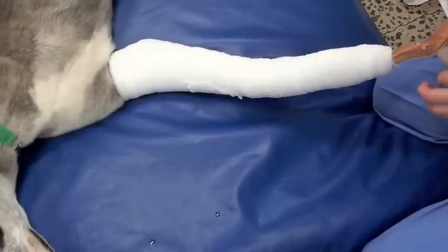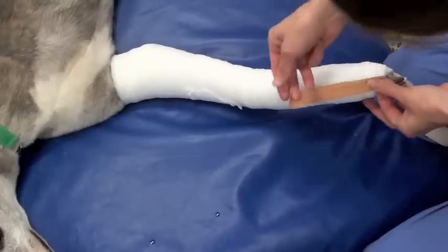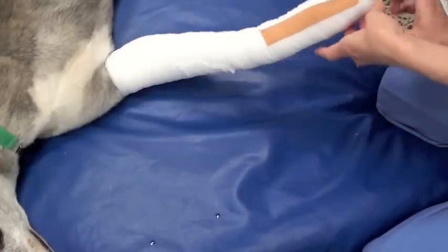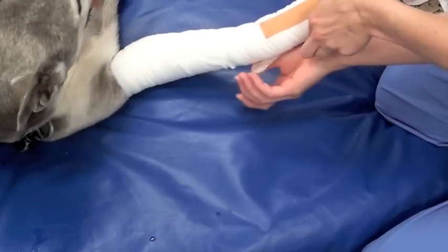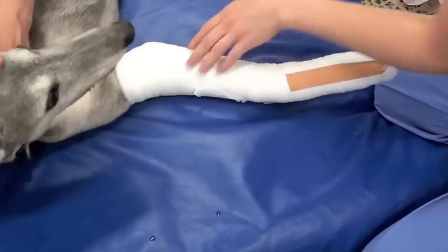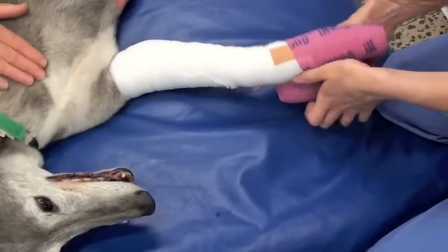The next step is to fold the stirrups back out and stick them onto the cling. That's what anchors the bandage to the leg and keeps it from sliding off — a very, very important step.